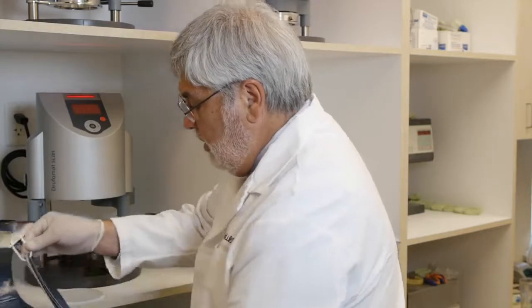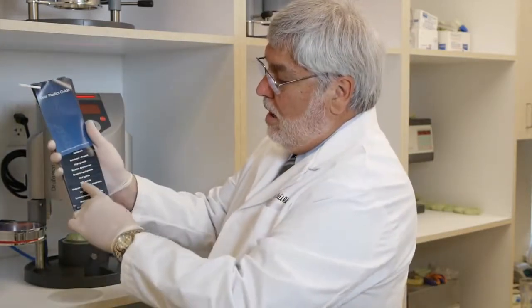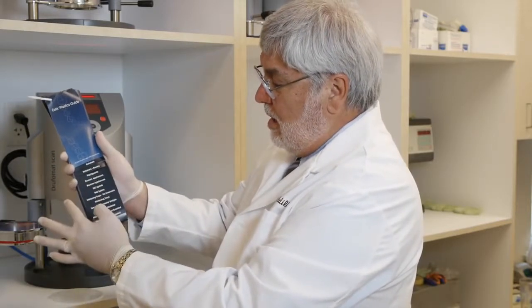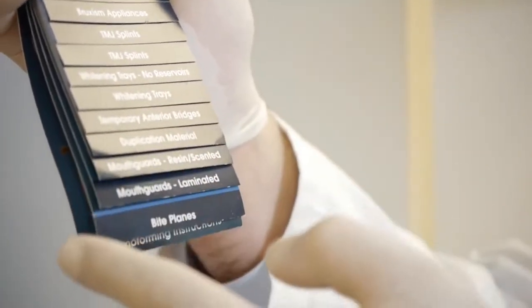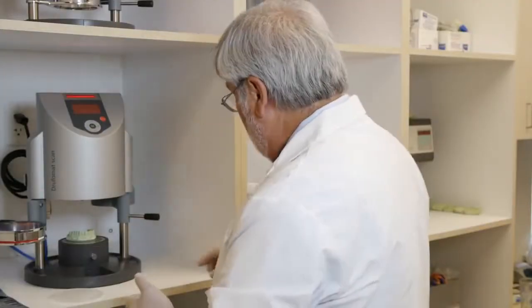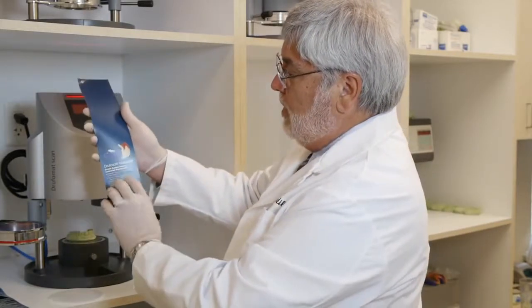Now with the machine, you get an Essix plastic guide. This gives you all the different appliances it makes: retainers, splints, night guards, whitening trays, temporary anterior bridges, duplication material, mouth guards, bite planes, etc. What we're going to be making today is the athletic mouth guard, Drufosoft mouth guard.